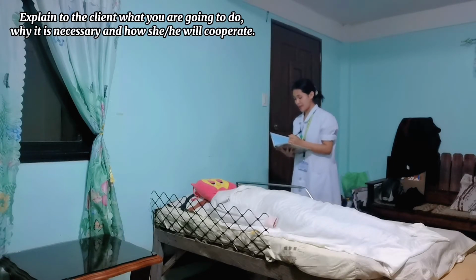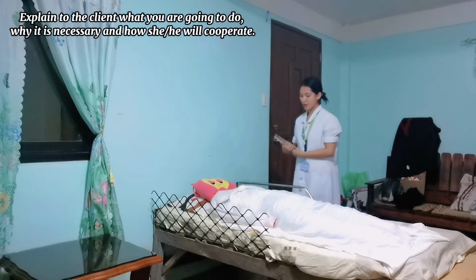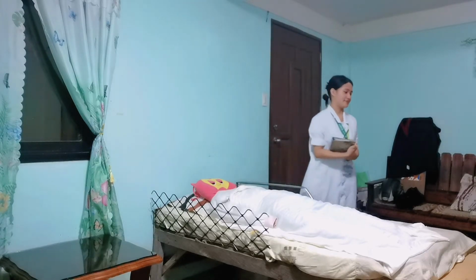How about your birthday po? Okay. So, Mr. Oli, it's nice to meet you po. So, first, sir, before I do the bed making, let me first gather all the equipment and the linens that I will be using. Is that okay, please, sir? Okay.